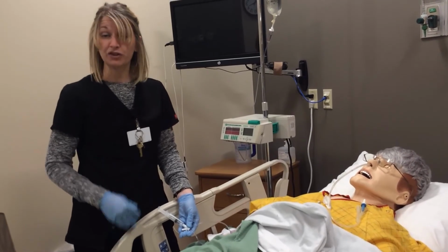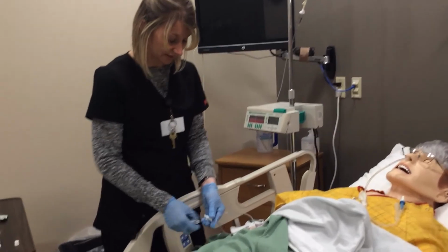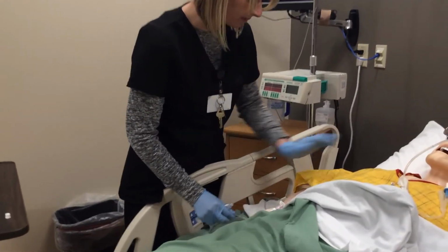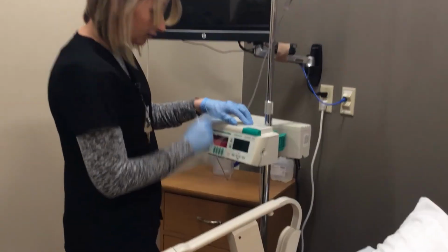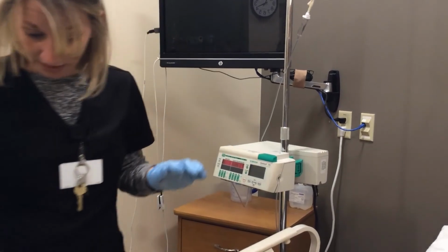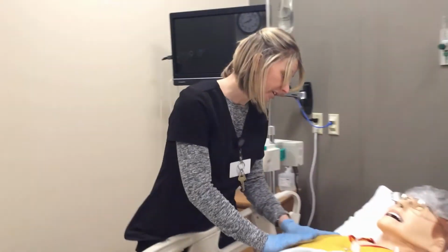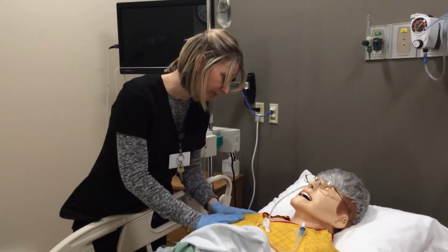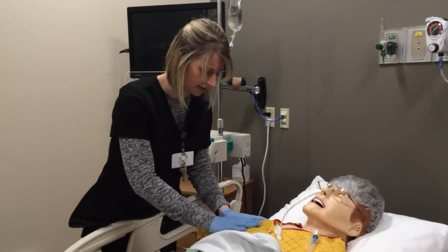So, again, for sake of time, let's say I flushed, pushed it over that 3 to 5 minutes, open it up to make sure my patient is doing okay. I'm not done, right? Because I still have to put his fluids back onto what they were supposed to be running at. I tell my patient, okay, you've been given these medications. Like I said before, I'm going to come back in about 15 minutes, reassess your pain. Hopefully your pain will be better under control at that point. Okay, Colin? He says, yeah, that sounds great.